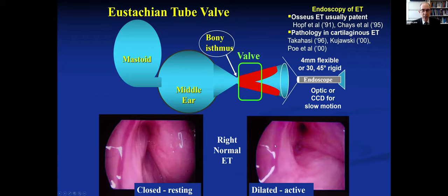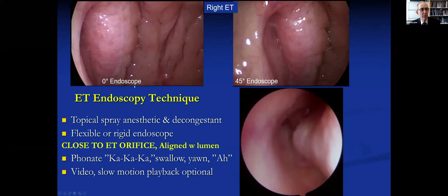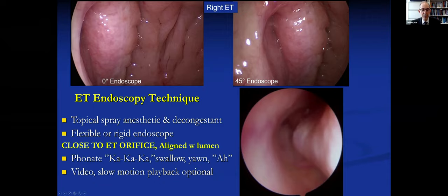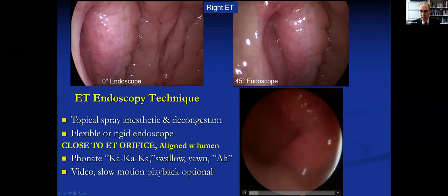We want to work on getting this view down the lumen of the eustachian tube. Usually not with a zero-degree endoscope — as we've been taught, you can barely see the lumen there. An angled view, either with your fiberoptic or with 30 or 45-degree endoscopes, is going to give you that view. These are right eustachian tubes; here's the torus and adenoid — we want to see into the lumen, both the membranous wall and the cartilaginous wall. Once in that position, have patients vocalize 'ca ca ca' to see just the levator moving in the floor and rotating the torus medially.